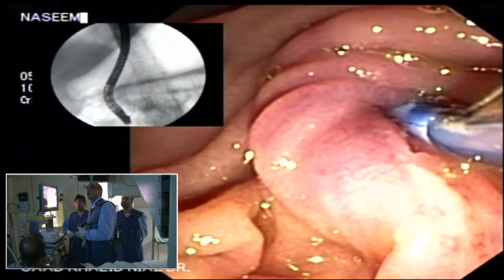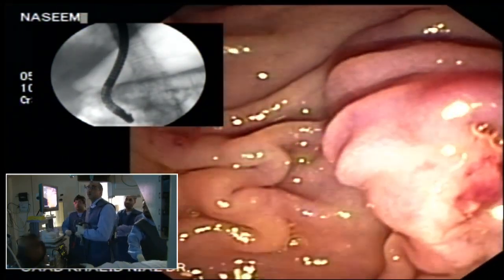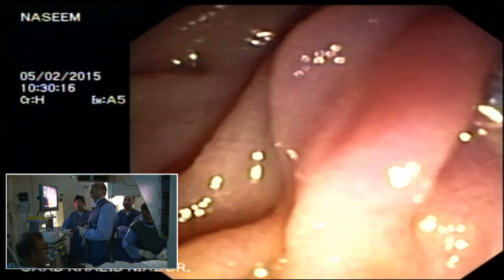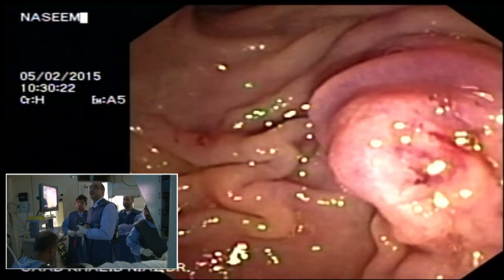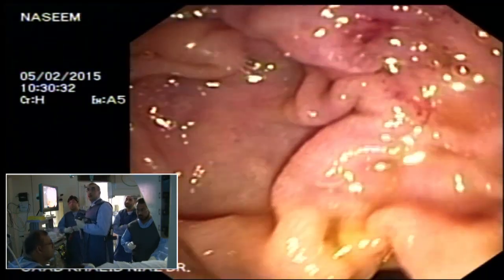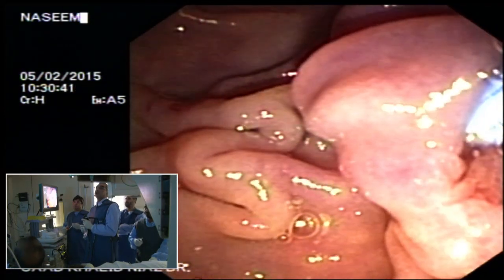अब यार, नो नो. अच्छा ठीक है. What happens obviously is when you manipulate, you will have some edema there. And the longer you manipulate, the more the edema. My rule is that I touch the papilla 4 or 5 times in one direction, in one position, and if it's not working, I change the position, either go into the long position or go into semi-long position to get a better angle. इधर बो करें थोड़ा सा.